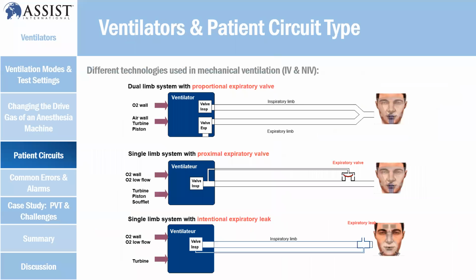Testing ventilator. When you talk about testing ventilator, okay, let me go through the ventilator patient circuit type.